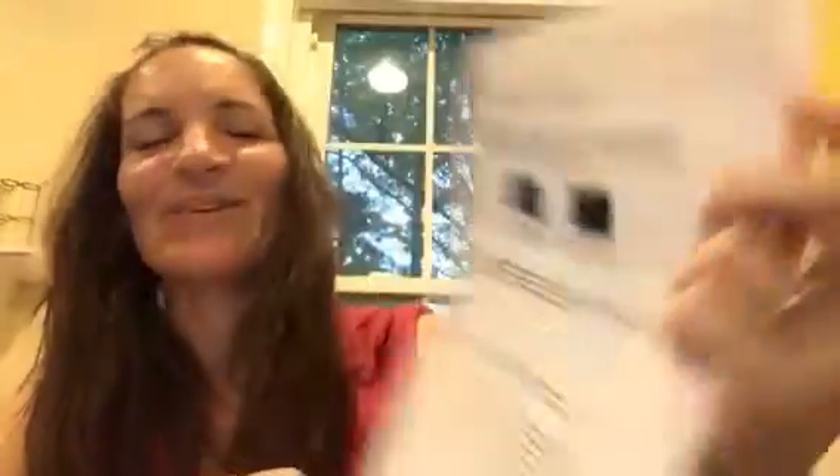So this is what I'm looking at. You might be hearing from your patients that their MiniMed 670G system may be asking them to check their blood glucose more frequently than what they are used to. Remember it is important to ask your patients if the system is requiring a BG or a calibration. The MiniMed 670G system can request the patient checks their glucose for two very different purposes.